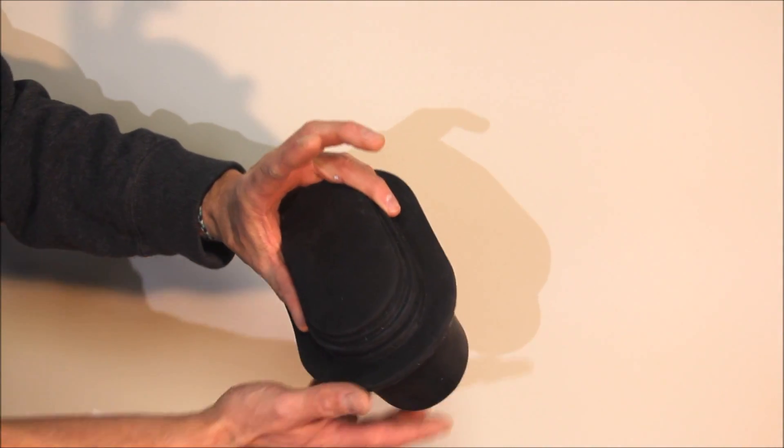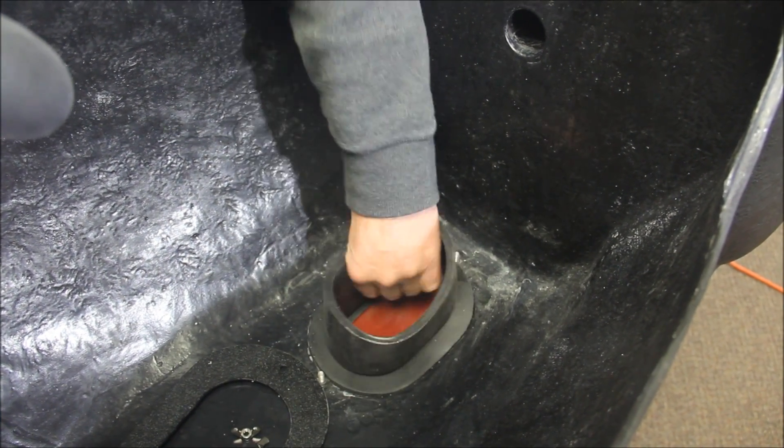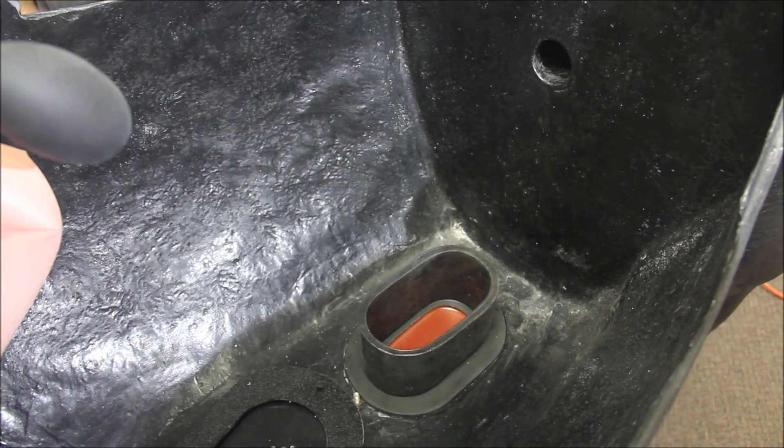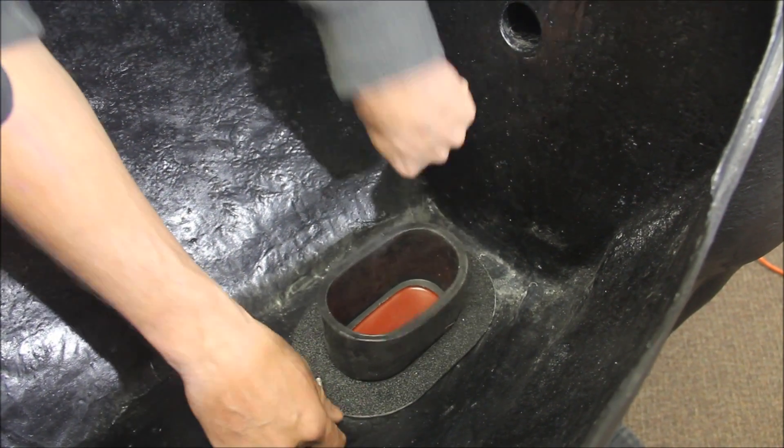Here is the abdominocentesis or belly tap plug, which is a replaceable part. It has a fluid reservoir for injections and features a palpable linea. It snaps into place and sits flush with the belly of the horse, and is held in by a plastic ring and two wing nuts.